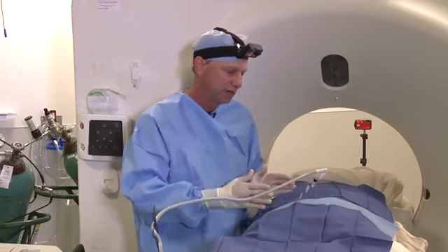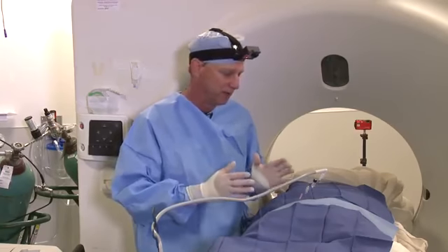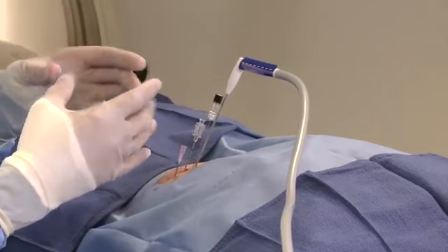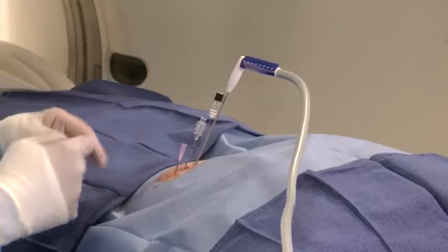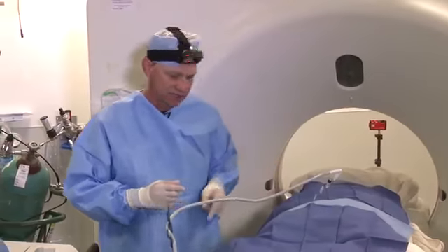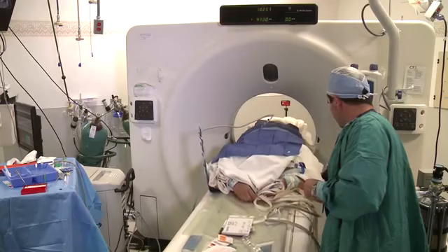Moreover, to me, the most important thing is apnea. When we take our pictures, we always have apnea. The kidneys move up and down, obviously, with respiration. With anesthesia, it stops at the same place each time. Very, very precise. It allows us to really lay these probes in where we need them. So let's take a set of 3 right there and see how we're doing.